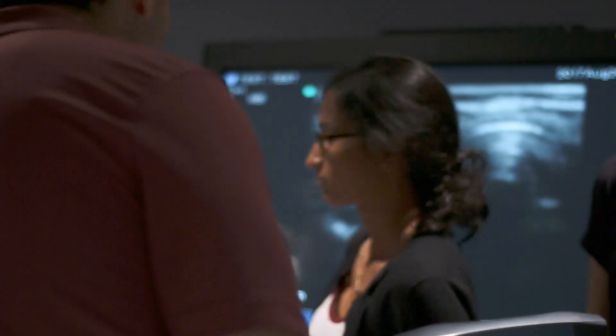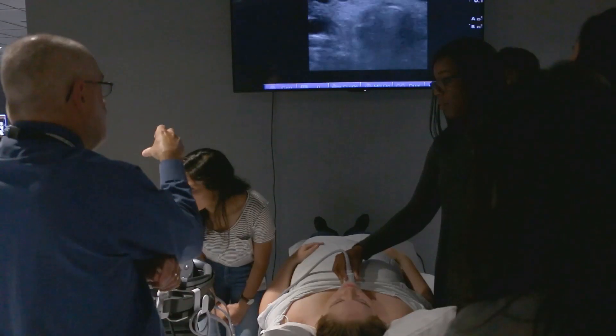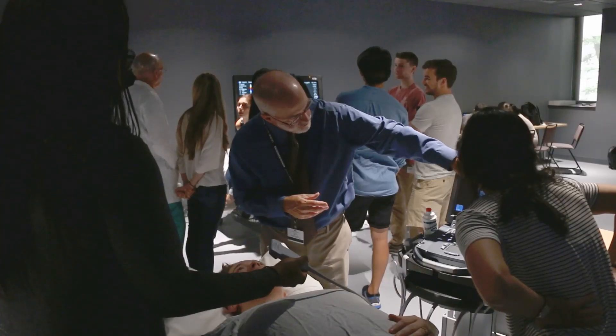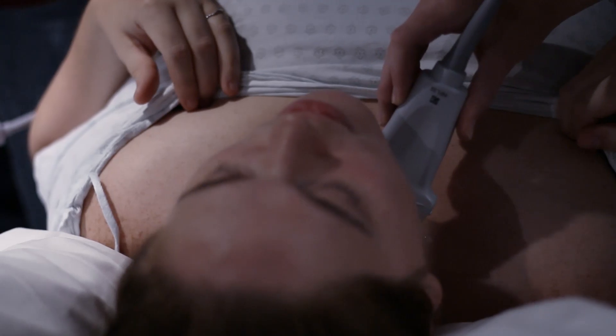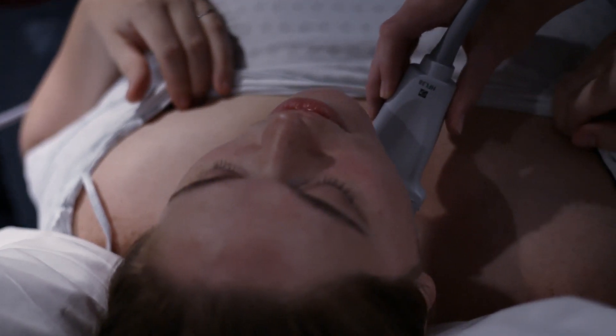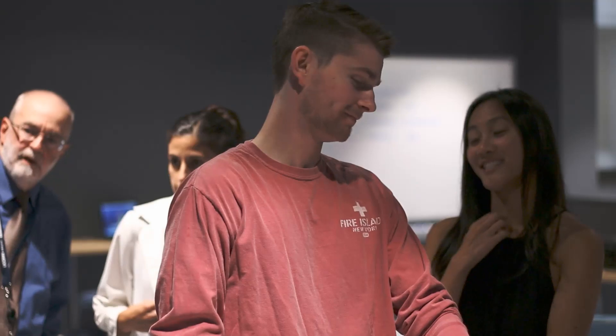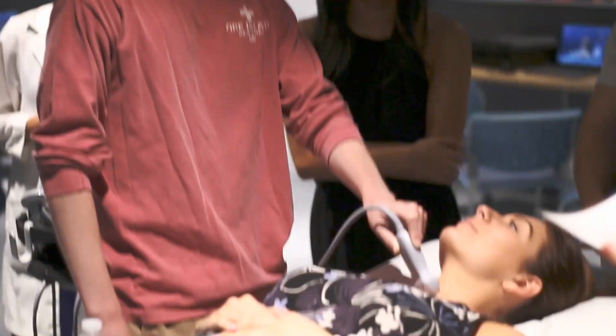Can anybody identify what we're seeing already? I see the right lobe. Right lobe is here — it's a structure. Patients get scans all the time, and being able to learn firsthand how to interpret them, how to read them, how to understand them helped me out immensely in the clinic.